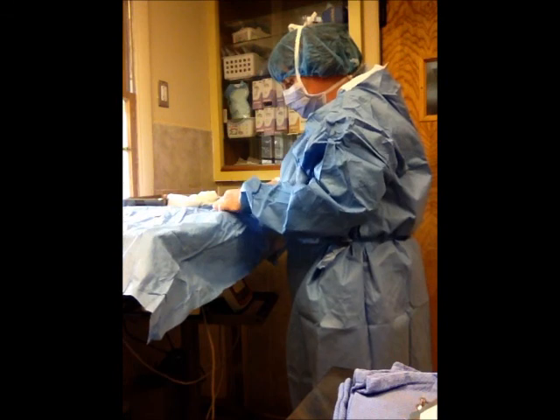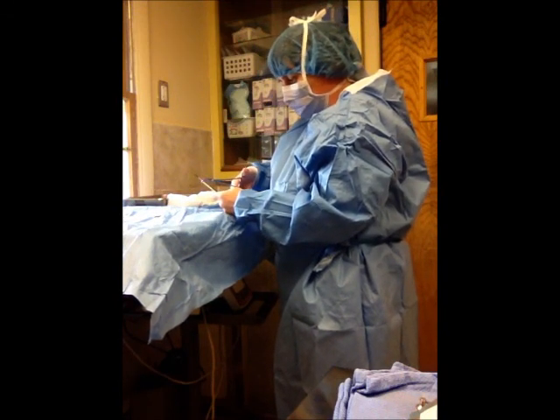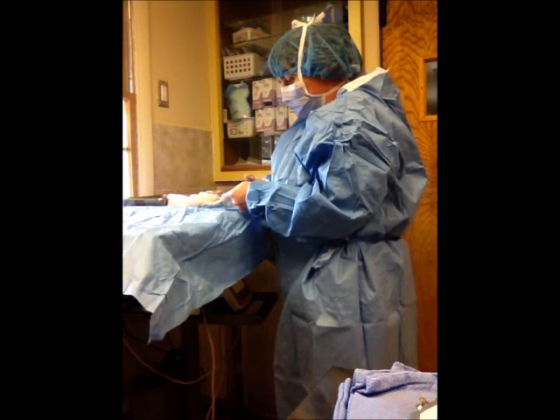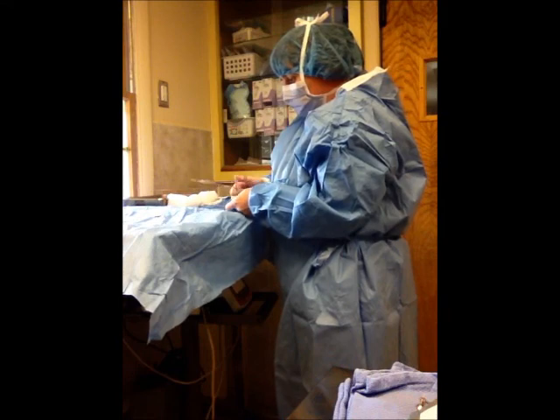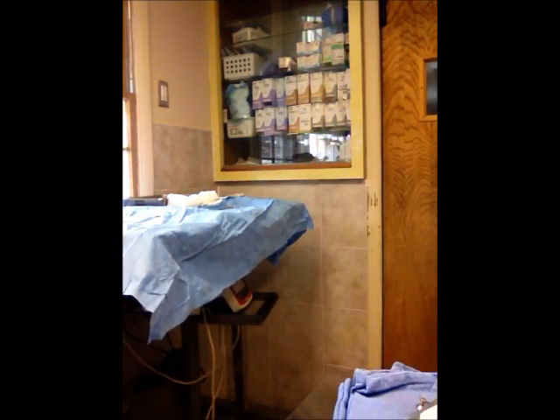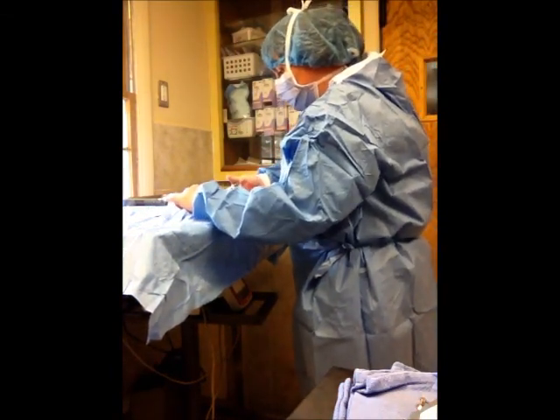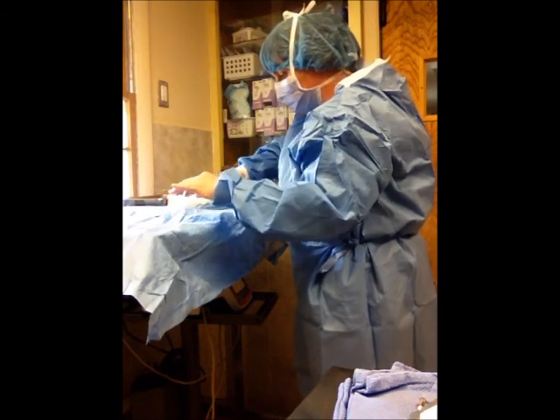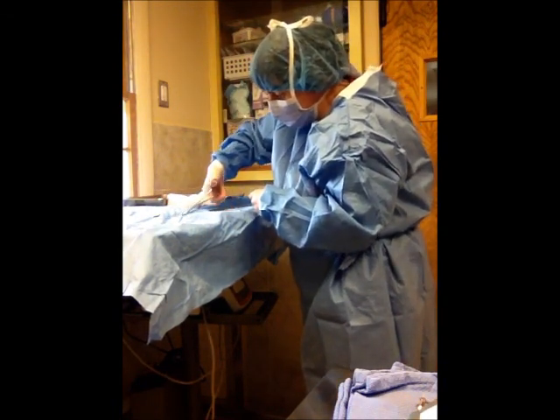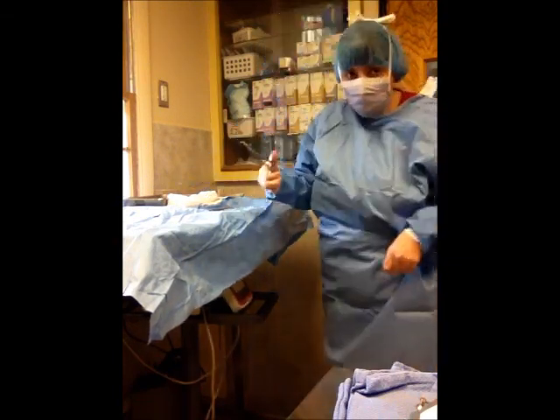For cleanup, we will usually take our sharps, we'll take our needle drivers again, and we'll lift the bottom of the blade and just slide it upward. And the blade will come right off, we throw it right into the medical waste bin. And the same thing with the needles from our suture material. It is a little magnetized, so it will stick to it.